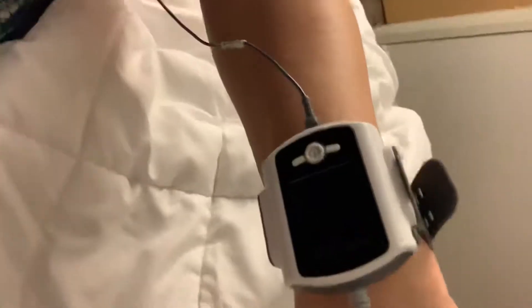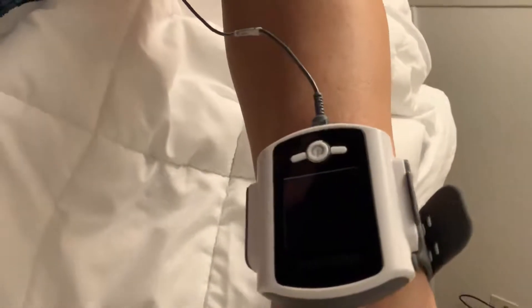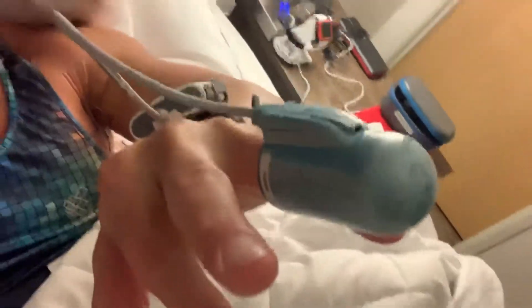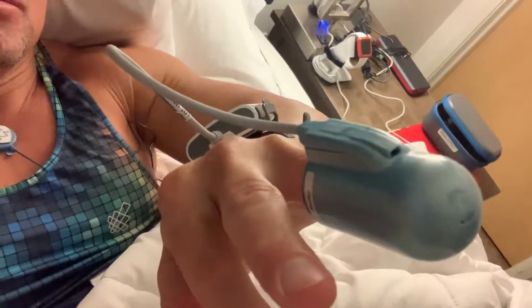I'm doing my first home sleep apnea test — it's the PAT technology, peripheral arterial tone. It's pretty cool. There's a little wristwatch component called the WatchPAT 300, and it measures seven parameters. I got this little finger probe that measures motion — if I'm moving my body and where it's located.